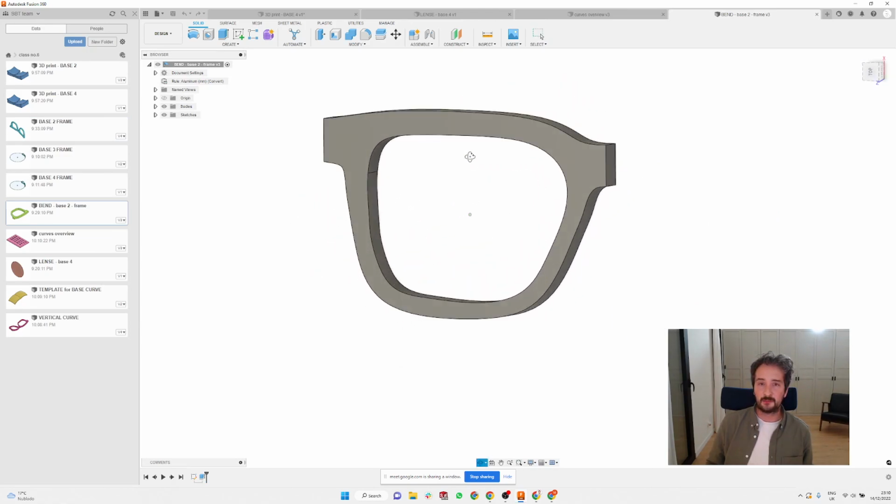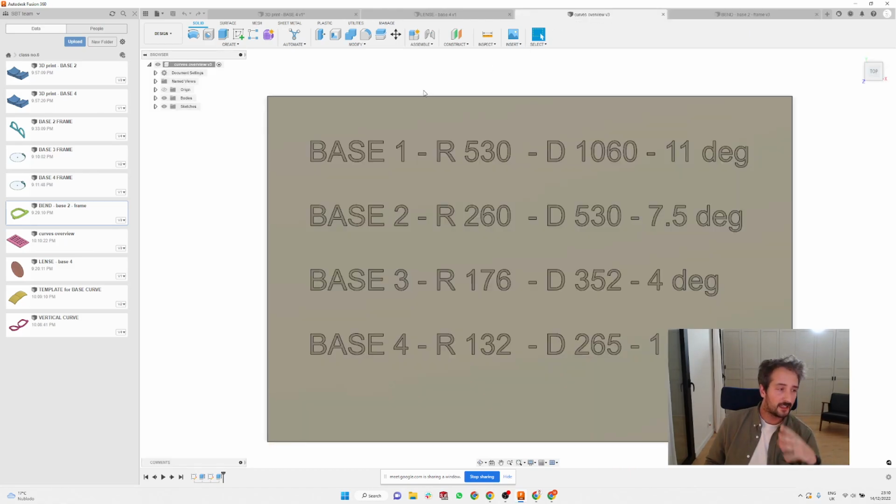Maybe let's start with a little bit theoretical thing. I just created myself this little base so that I know which radius is which base curve. Because I saw on a chat that there was a lot of discussion about what base curve basically means. So I took this measurement from lenses, and basically for each base, the higher the base, the bigger the curve, which I think everybody understands.